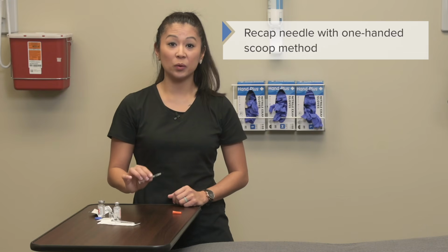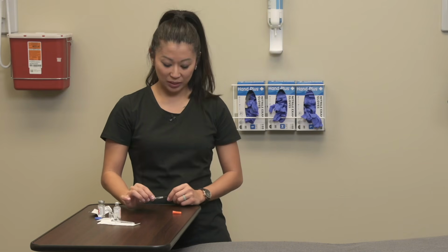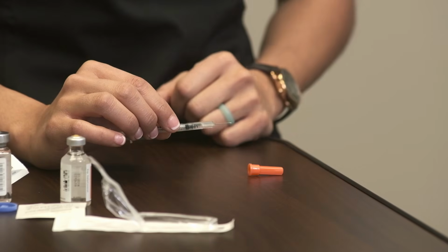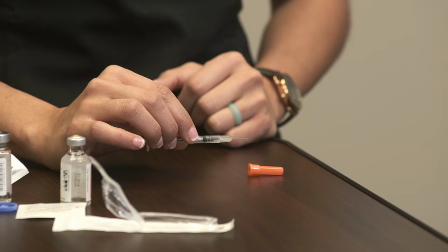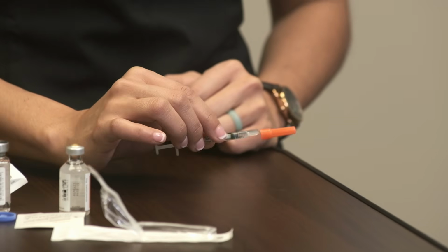So note that I'm going to take my hand, I'm going to place the needle inside the cap. It's really important that I don't put the needle on the table because this is sterile. So now you see me place the needle in the cap. I've scooped the cap up.